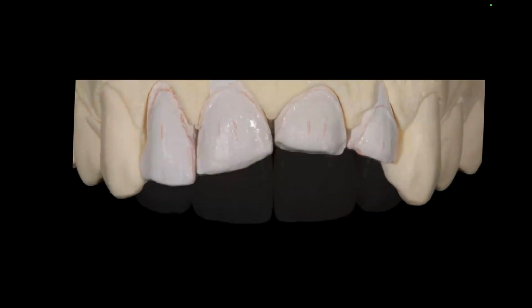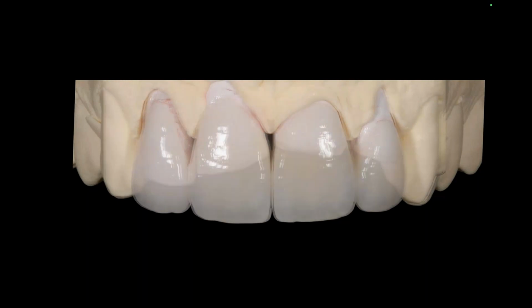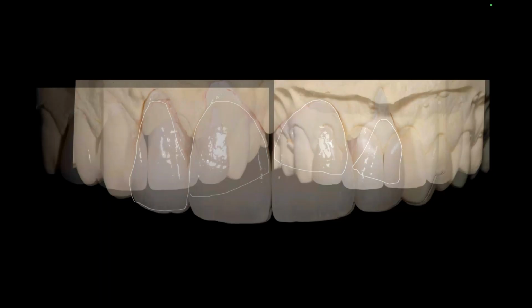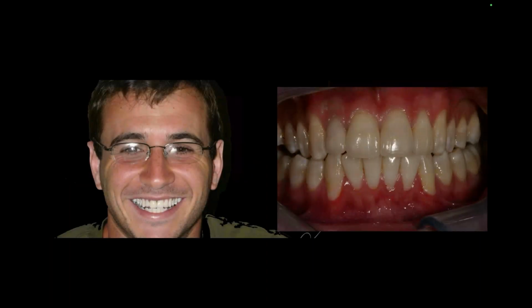But just to go back one, you can see I have zero space to work with in the cervical and in the mid-third areas, and I have too much space in the rest of the restorations. So the goal was to manage those restorations by using my materials to give me the opacity and the translucency I need, which is why feldspathic is still kind of king for me, because I really have the ability to do all that with feldspathic materials, where when I get into monolithics, it changes the game a little bit, and I'll touch on that as hopefully we have time to go through it all today.